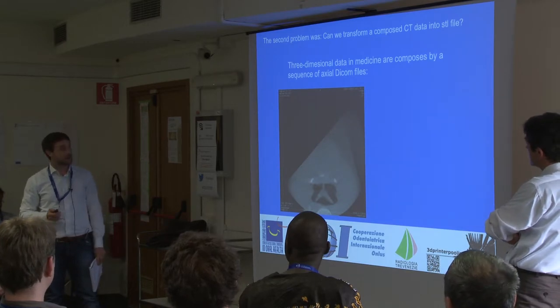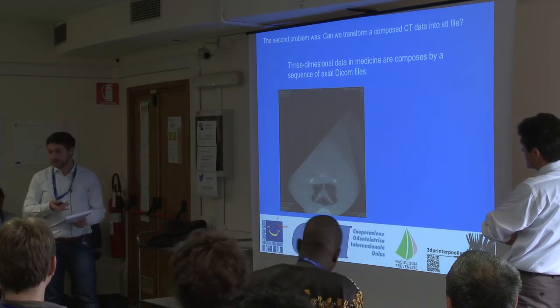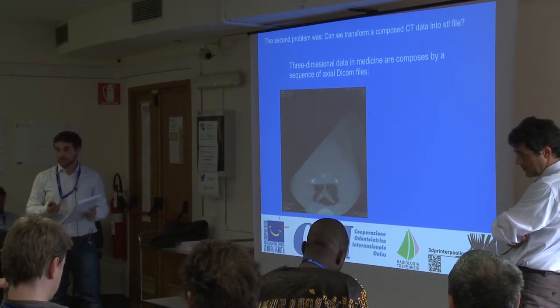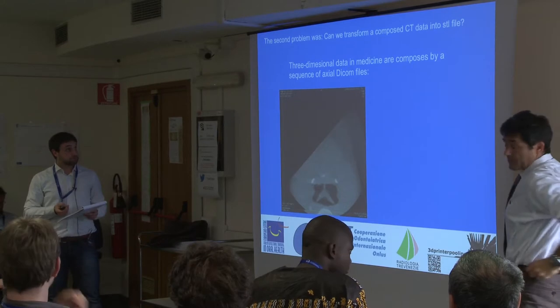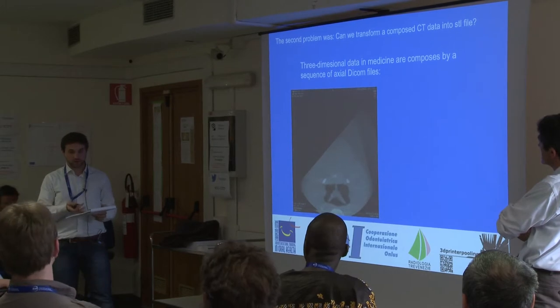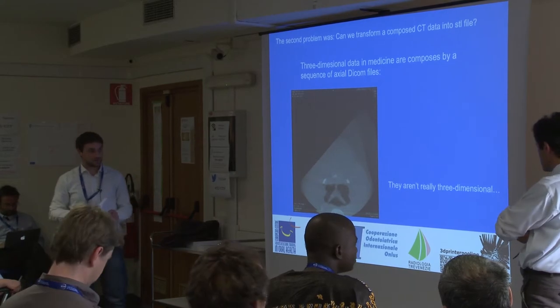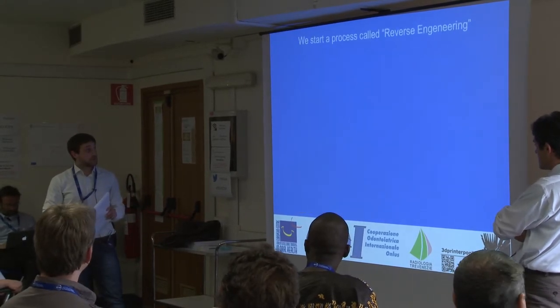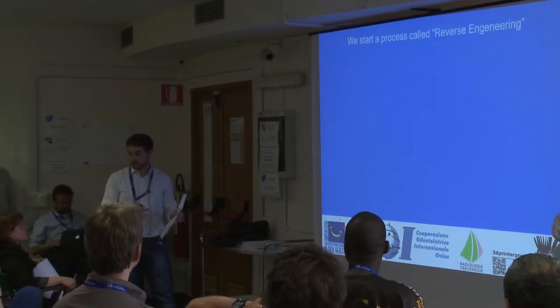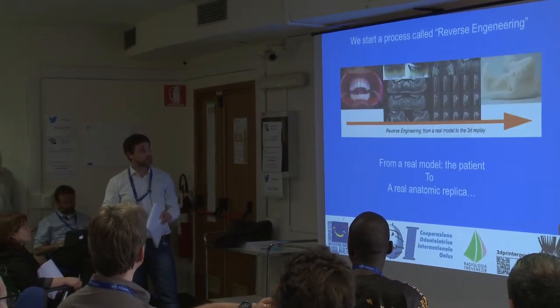In medicine, three-dimensional data are composed by a lot of sequences of images. A single image is a two-dimensional image, and the volume is composed by a lot of layers, and they aren't really three-dimensional. So we have to start a process to transform the CT data into the 3D replicas.